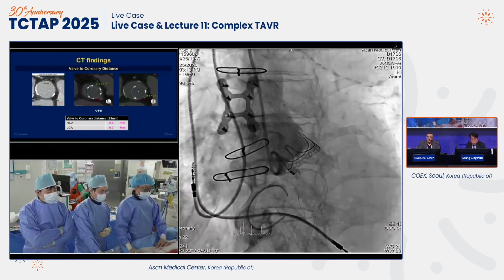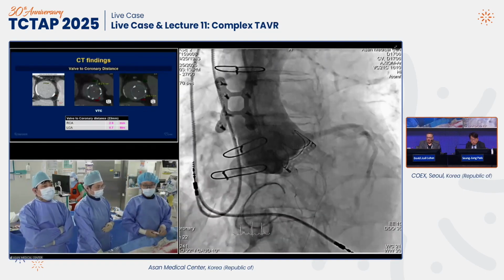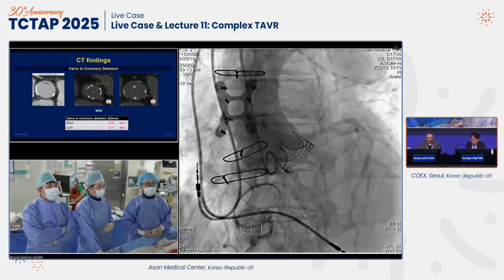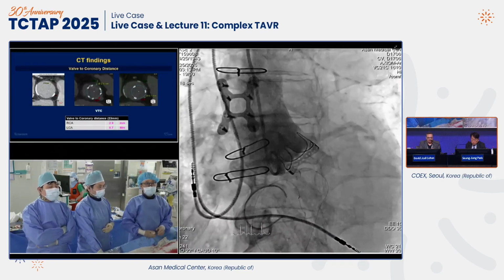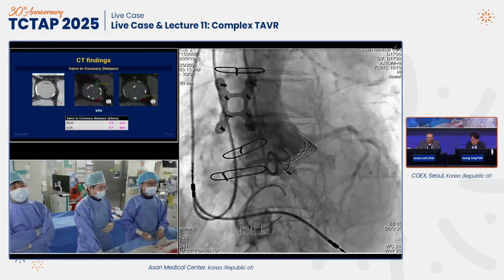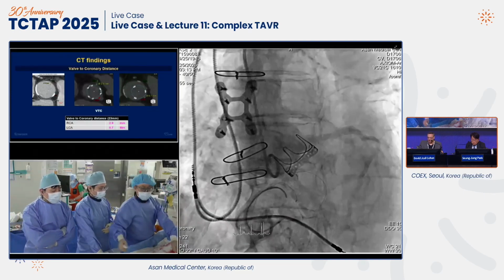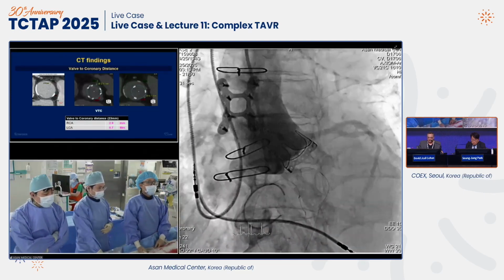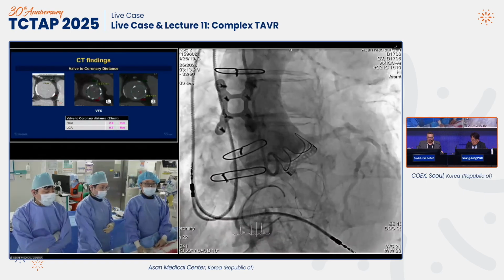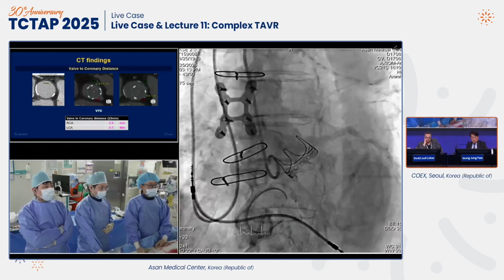The other thing we think we are going to have very soon is something called the Telltale wire, which is a special wire built for BASILICA that is insulated. It comes with some accessories that make it substantially easier, and it's going to be commercially available, I think, maybe later this year, which will make it even a little bit easier. We've had good experience with that, and I think this is a good case for it. It's not an easy procedure, but it's a good case for it.